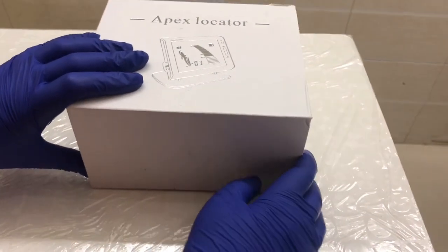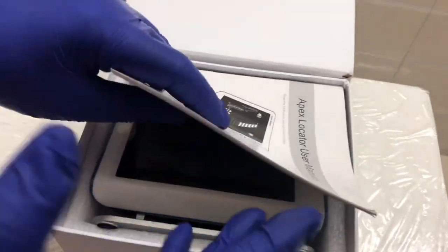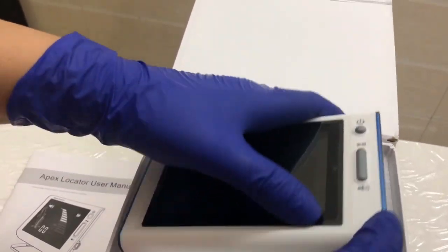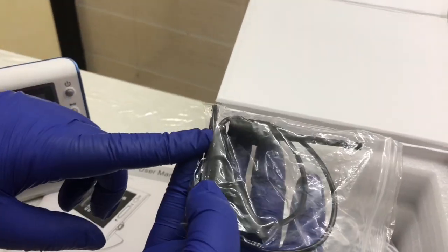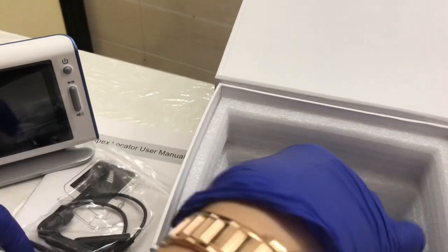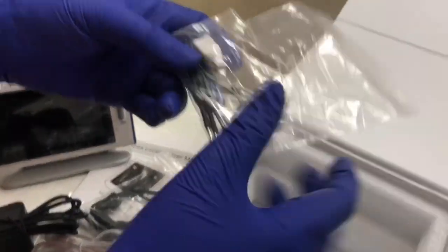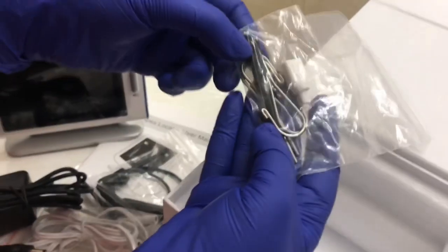Let me just unbox this quickly and tell you what's inside. There is one manual, a colourful LCD screen, auto-clavable file kit, measuring wires, one adapter, tester, lip hook, and touch probe.